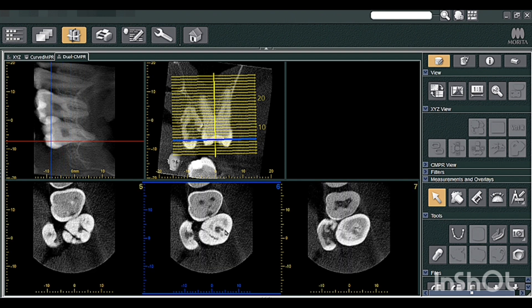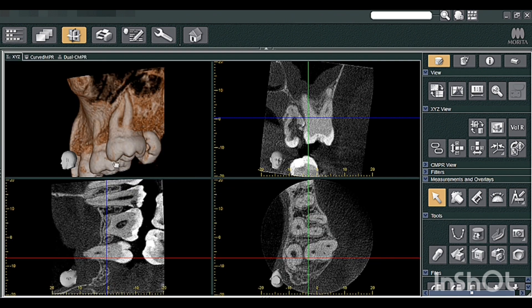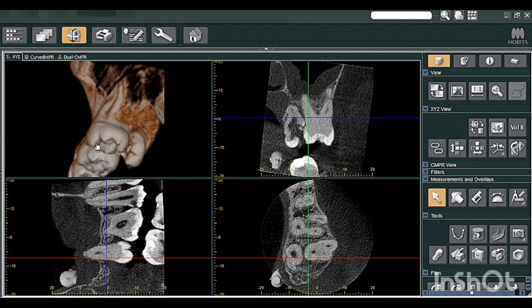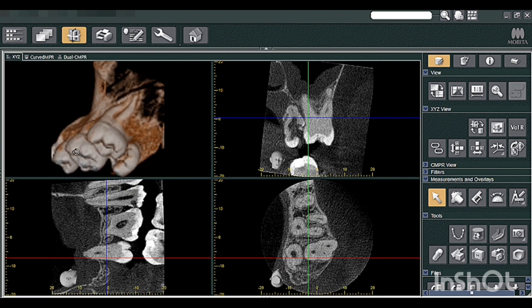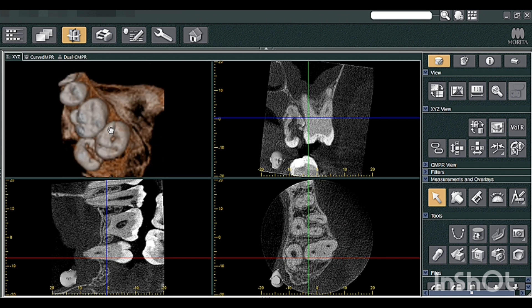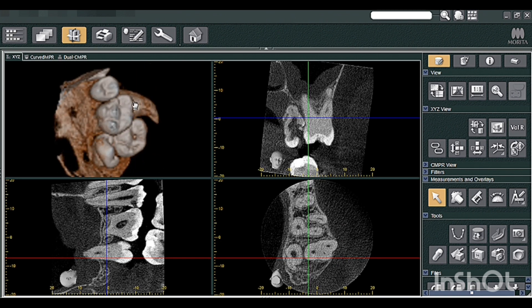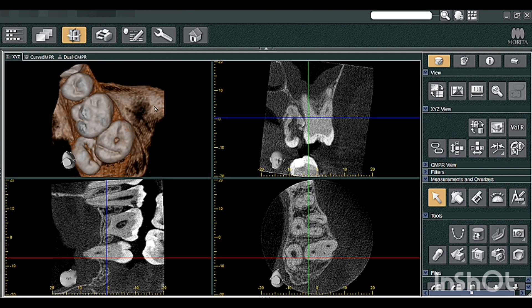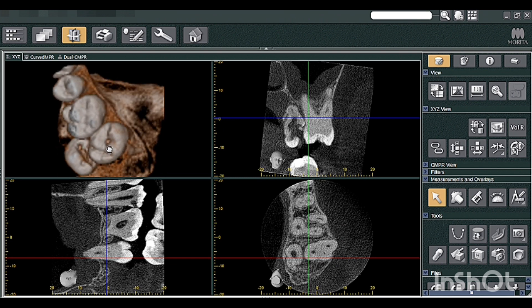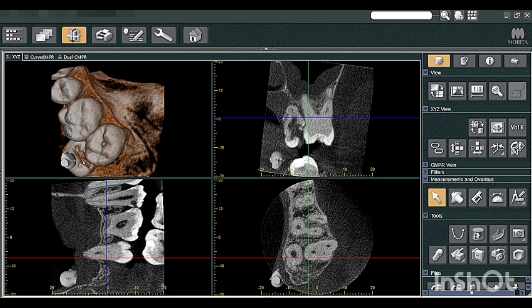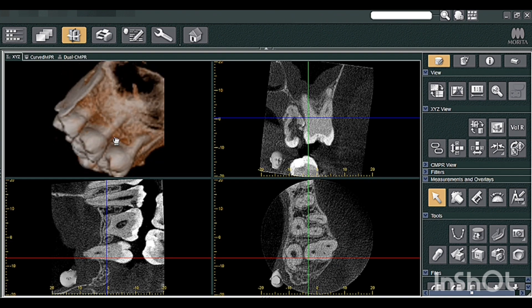Coming to the caries of 27, this is the occlusal pit caries of 27. To confirm, you can always confirm it in the volume rendering image. Volume rendering images are not very reliable but they can be used as a good patient education tool. You can still get a good visualization of 27 occlusal caries evident here, and this is 28 that is palatally placed.